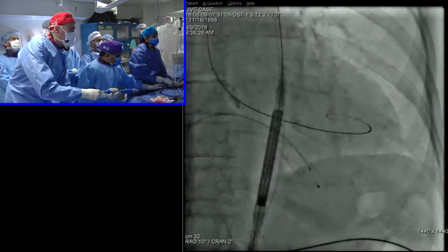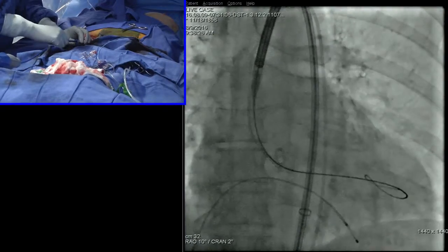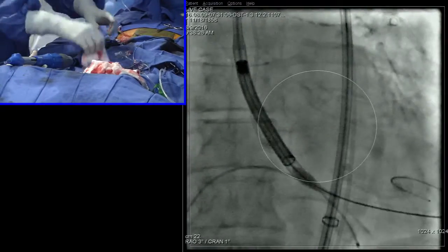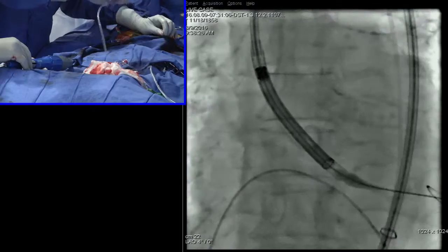So I think part of that is the delivery sheath, which has a no-touch kind of technique for going across the valve, across the arch. Part of the stroke occurs, we all know, because of the debris and scraping. It's going to come really caudal.